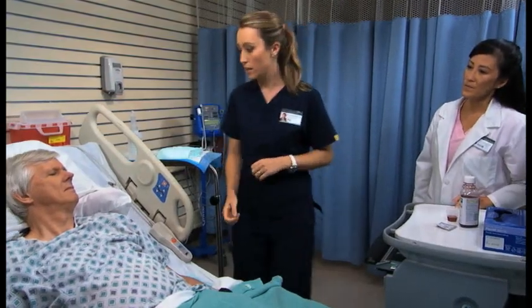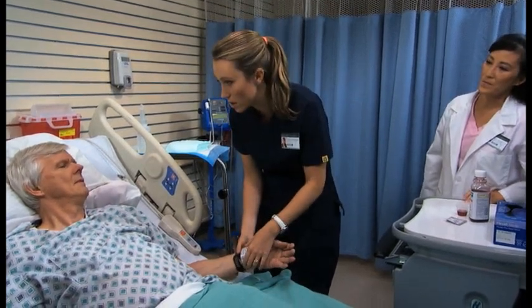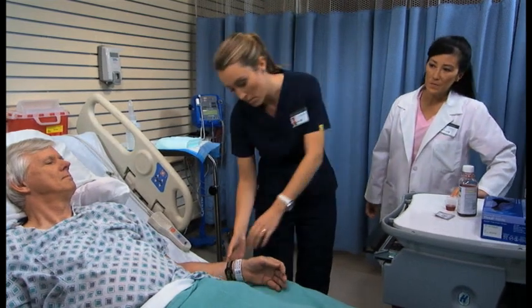Can I double check your ID band, please? Thank you. Your name and birth date? Max Lumet, April 24th, 1949. Great. Now I'm just going to check your ID number and scan your ID band.